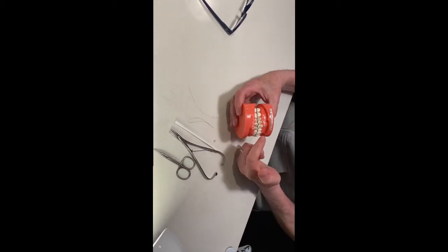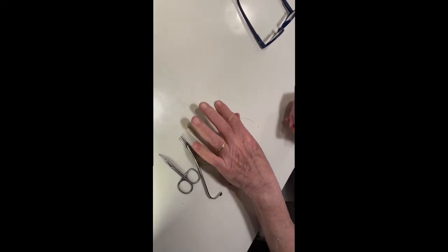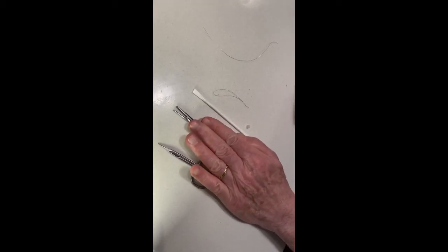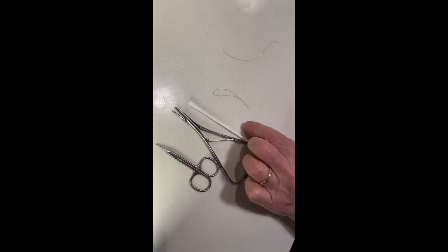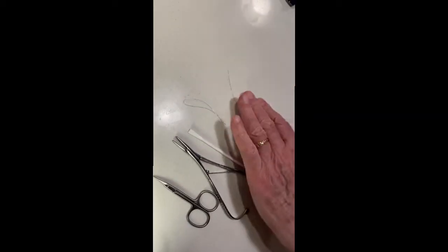Here is the wire, and we're going to remove it, and we're going to rewire it. You will need, for this, a cuticle scissor, your twisting instrument, an instrument to help you effectuate a distance between your teeth, a little piece of wax. This is what we're going to create, that little piece of wire from this.